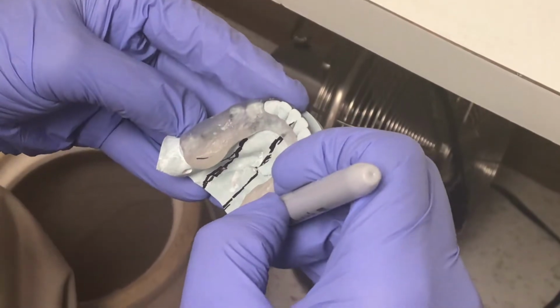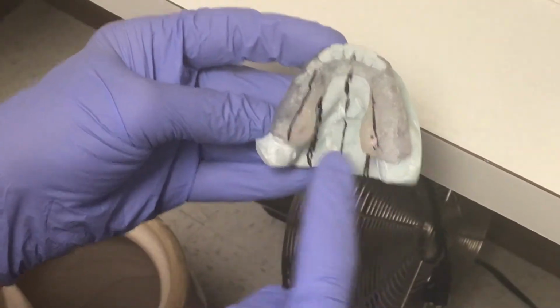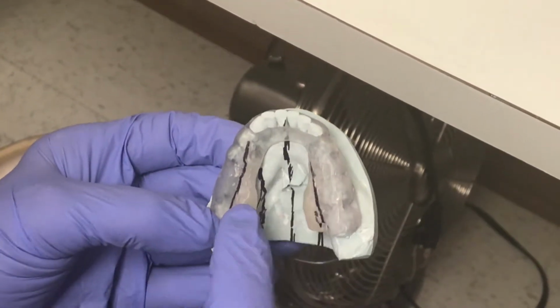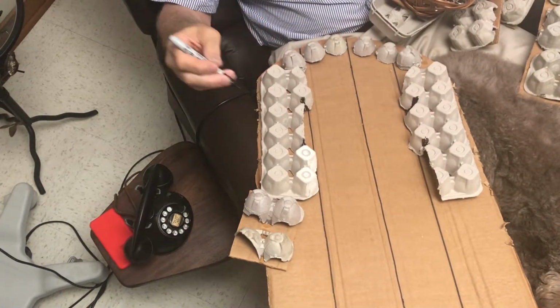So we start usually at the back of the second molar, and you want this to touch this line that we're going to show you how to draw down the cast, and the contour of that tooth has to be in line with that line. You can't go over it. There are some sacred parameters that prevent problems with speech, swallowing, and speaking.